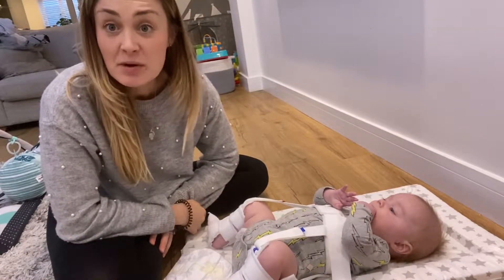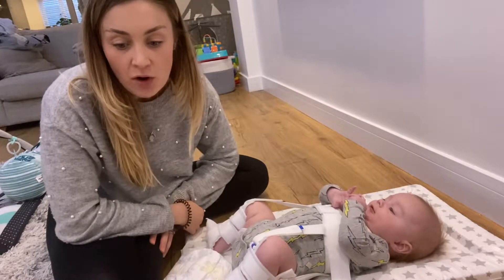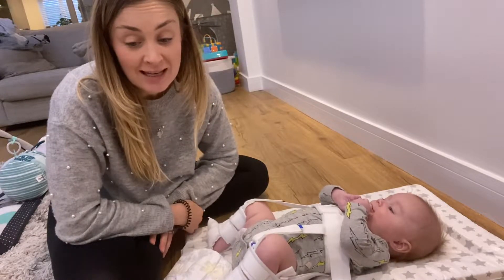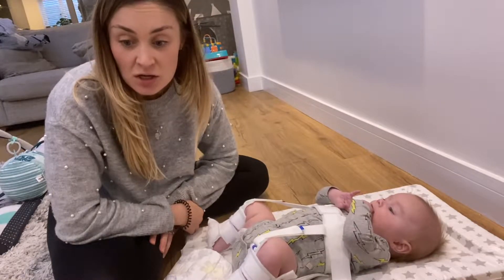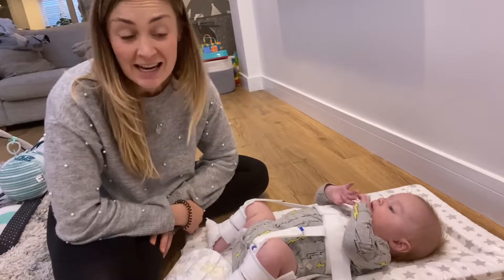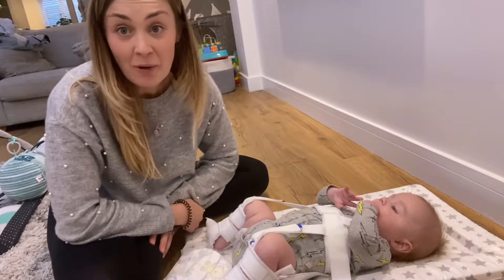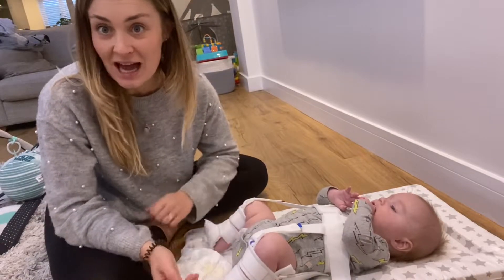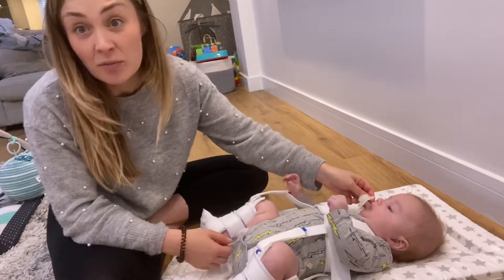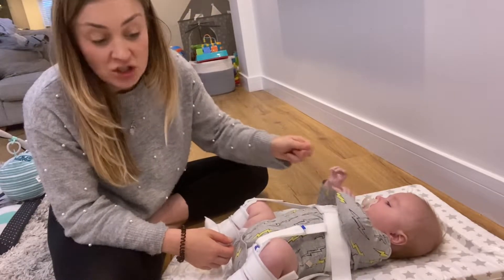Hello, so this is day 50 with our Pavlik Harness. I just thought I'd come on here and do a quick demo of how I change Max's nappy. I've been seeing lots of comments in some of the hip dysplasia groups in the last few days from people just starting out on their journey asking questions about nappy changes, and it actually was one of my main concerns when Max first went into the harness.